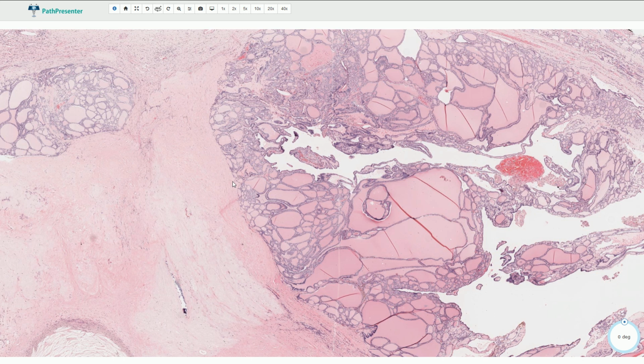Follicular adenoma is usually solitary, and it is a distinctive single nodule in the thyroid gland. Multinodular hyperplasia is very common. It can be associated with iodine deficiency, which could be amplified by tobacco smoking. Sometimes it can be associated with consumption of goitrogenic food, such as broccoli or Brussels sprouts. Sometimes it could be caused by medication, and the genetic predisposition also plays a role. So in most of the cases, the primary cause is not really clear.